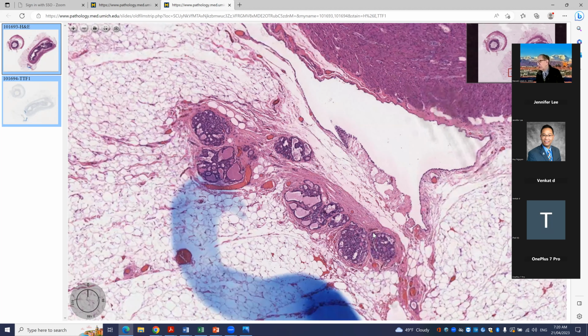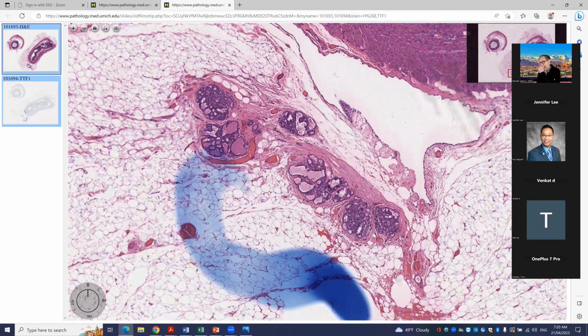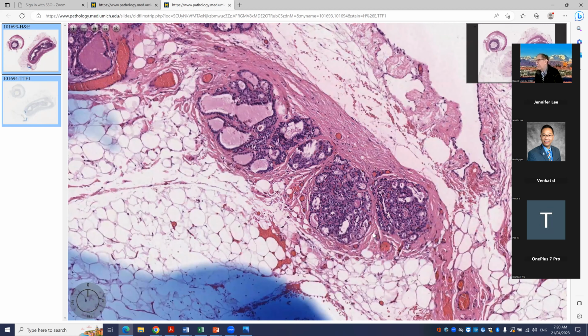So as you look at this, any of you have any thoughts about this? Dr. Leah Shreveport, if you saw this, what would you think if this was one of your specimens that you were managing?